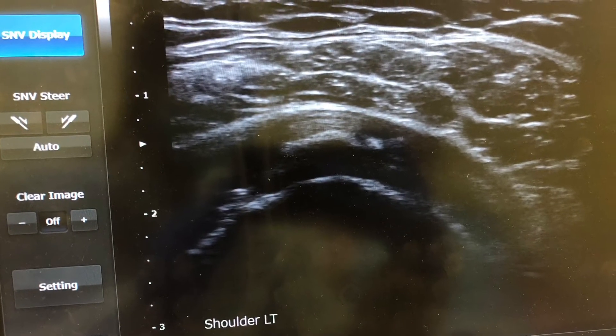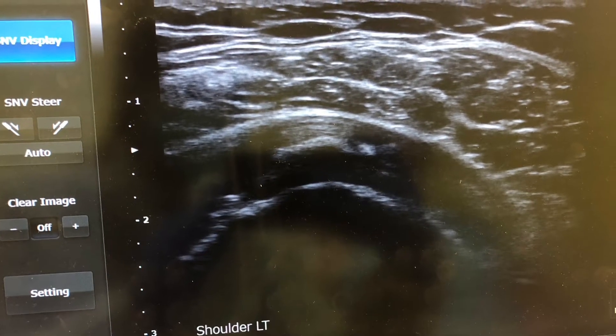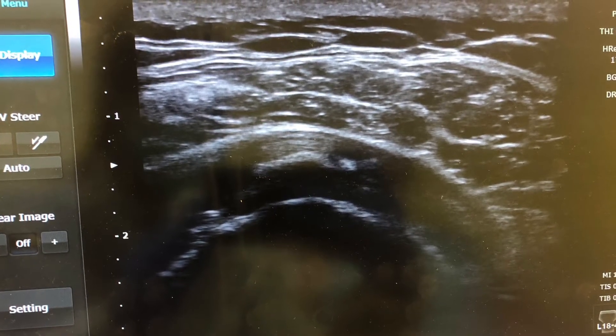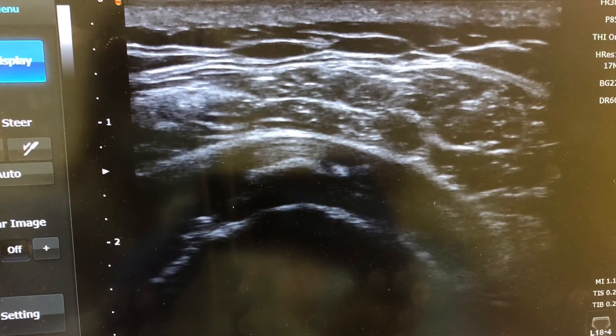Here we are looking at the supraspinatus tendon on ultrasound, with the calcification within the tendon that we're going to try to break up with the procedure.